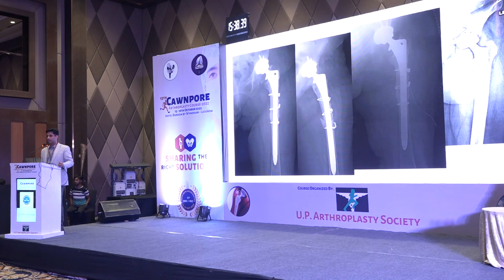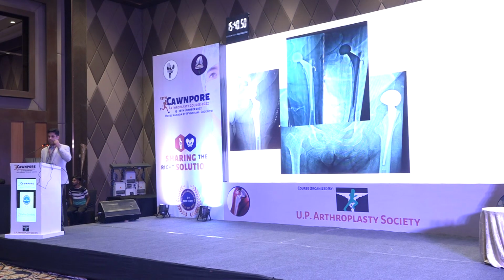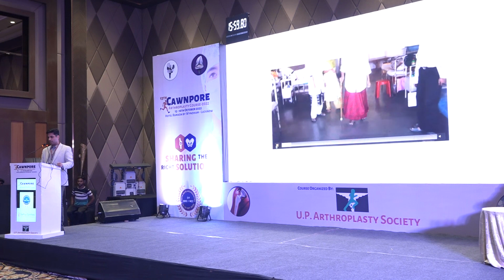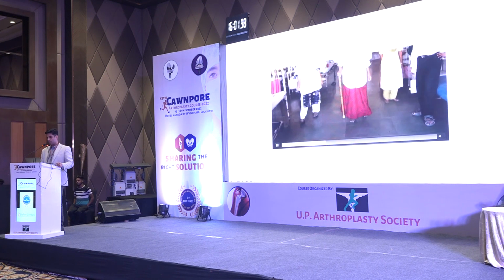And so, of course, in this case, I had to revise it to a long stem cemented because of financial constraints. And this is what I did from the top. I removed all the cement piecemeal. So this took time. And I caused a little bit of a fracture in the trochanteric region, so I had to wire that. So that's her, walking at 4 days. So she was much better after she started walking. So that was good.